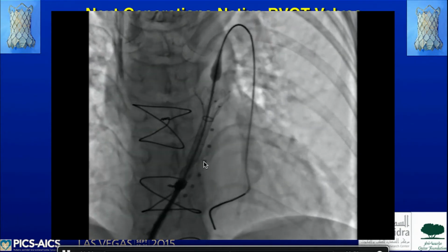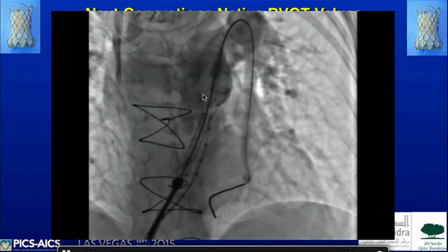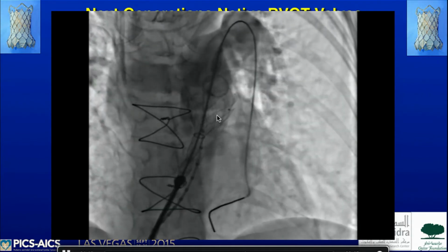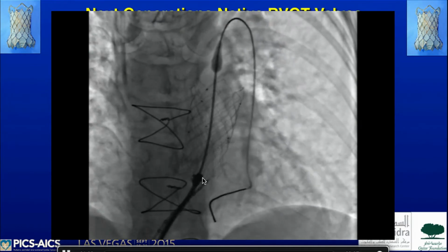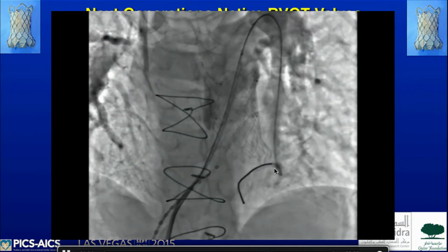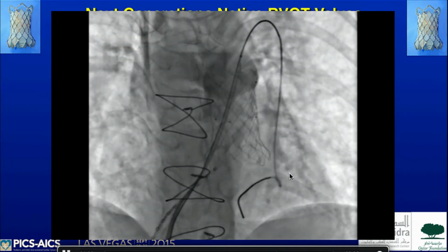So the handle is a controlled release. You can see it, a very nice position there towards the bifurcation. There are radio-opaque markers to show you the valve. You can see them right there. And then finally, the release of the valve in the position. Then you repeat the final angio. You can see that there is no insufficiency at all. The valve works really well.